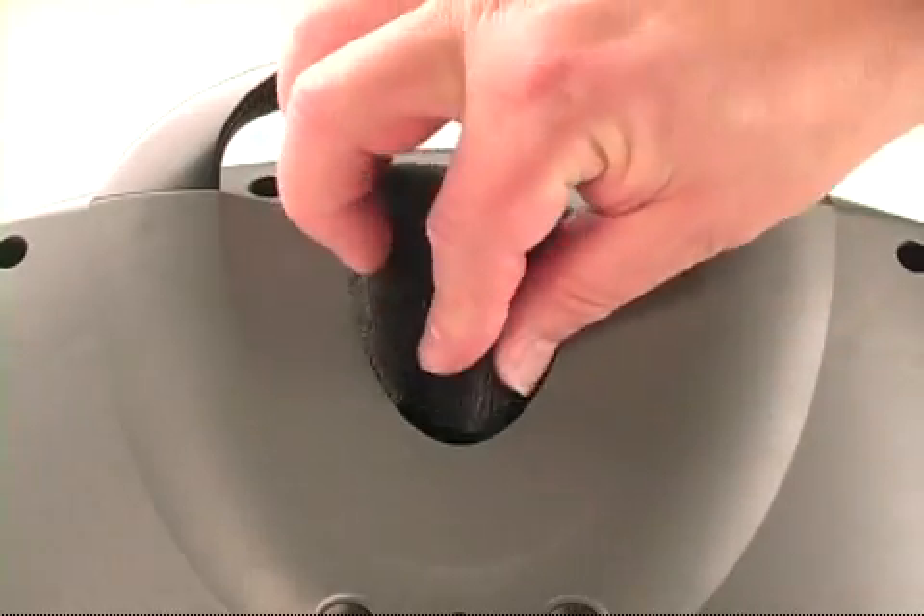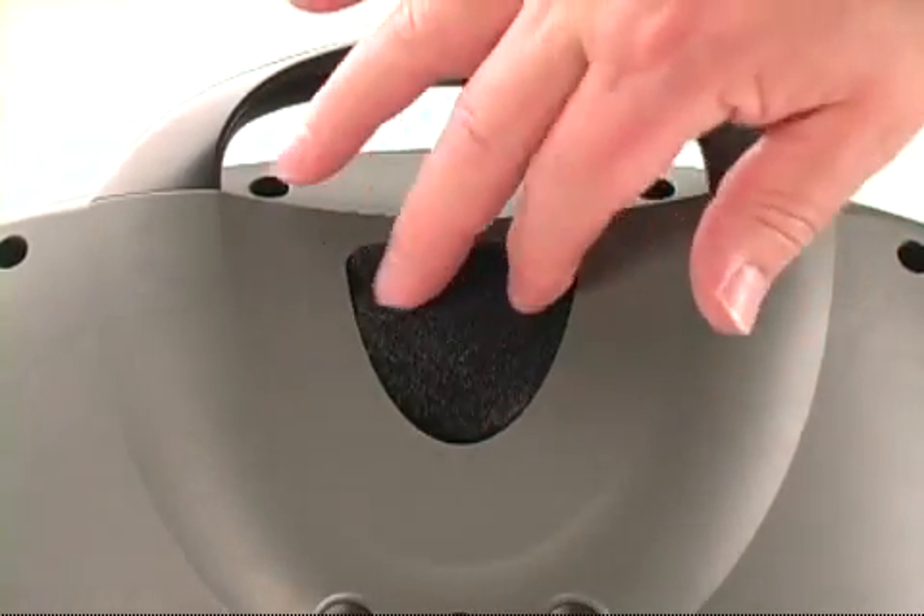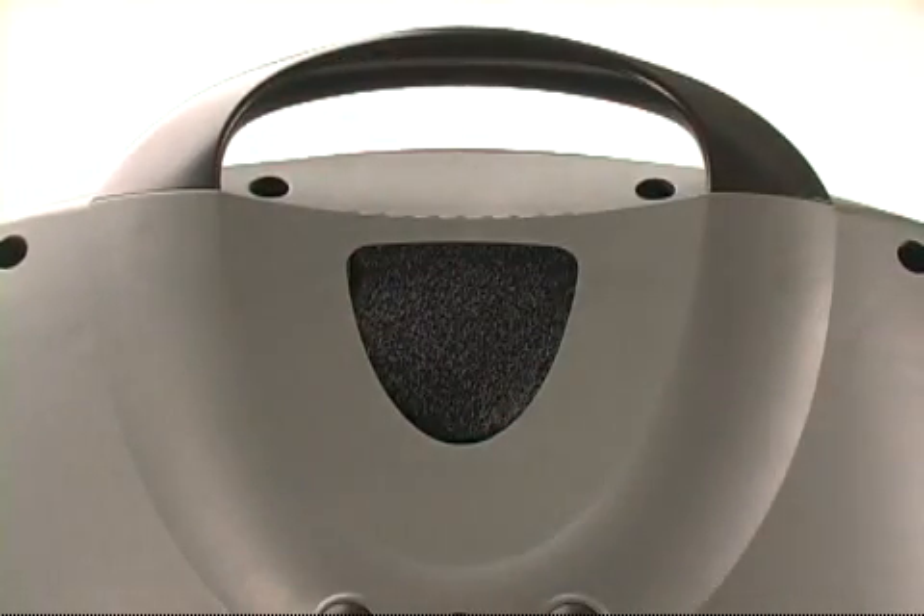Having a second air inlet filter facilitates the filter cleaning process. If you didn't receive an extra filter with your Eclipse II, you may want to request a second air inlet filter from your home care provider.